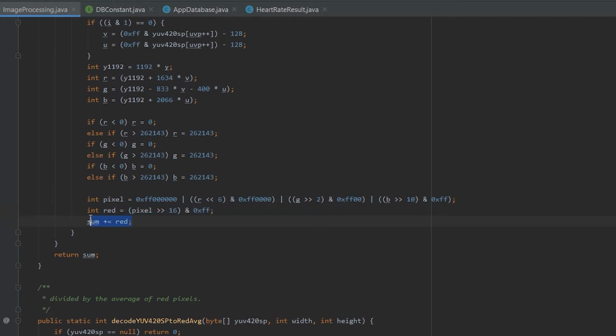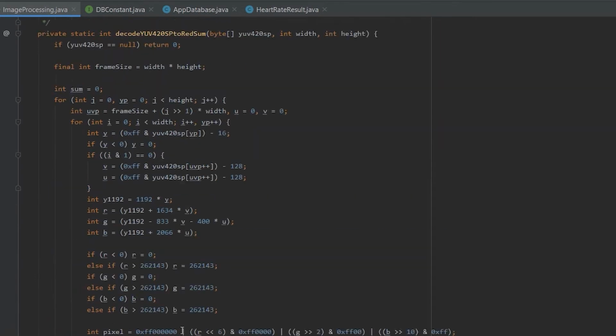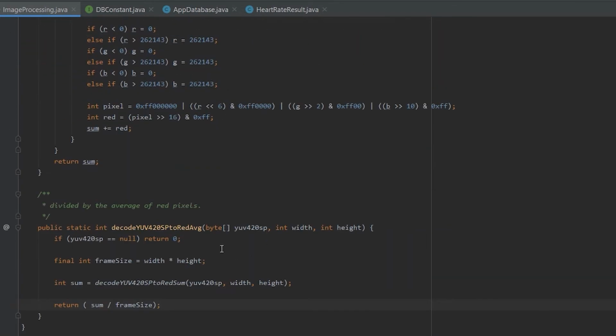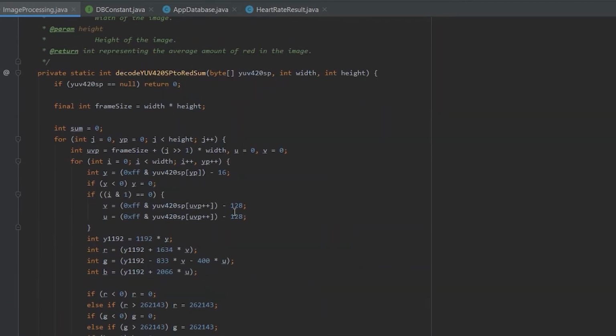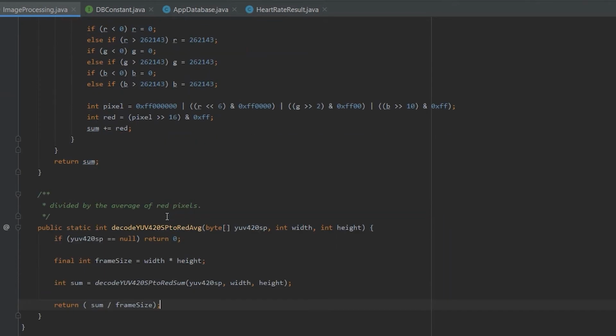After that, we are adding it to the sum, and that sum is given back to the red average, and that average is taken over the whole frame size. So in short, we get a frame from the camera, from the video, then it's sent to decode and convert the YUV format to RGB, and from that RGB format we extract the red value, sum the red values in the whole frame, and then take the average of the red value in the frame.